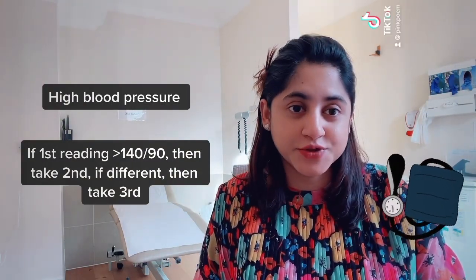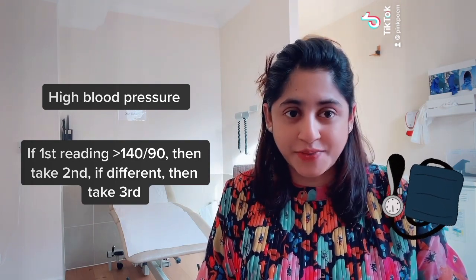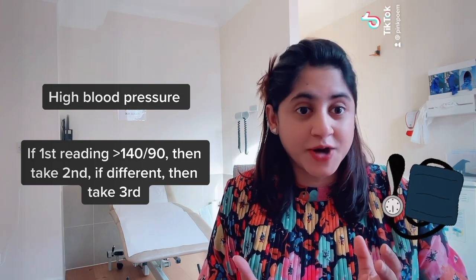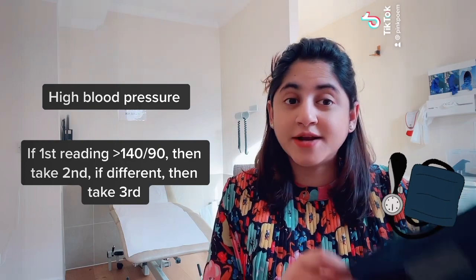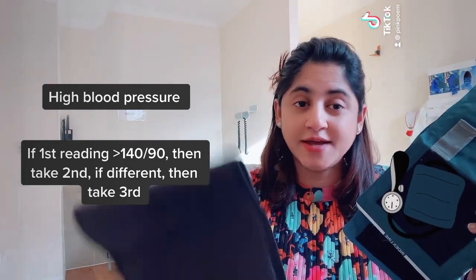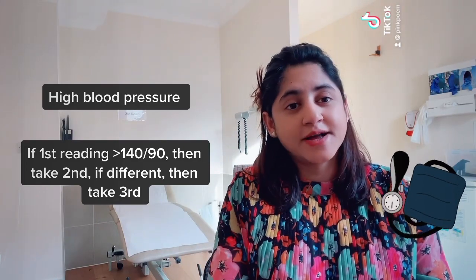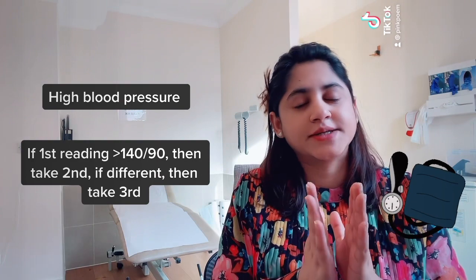I'm the Pharmacist prescriber. Today I'm going to discuss high blood pressure in patients. In order to monitor blood pressure, you need to make sure that the appropriate cuff size is used. This cuff goes around the arm, so it has to be appropriate.